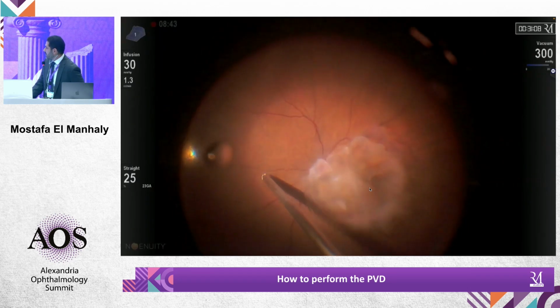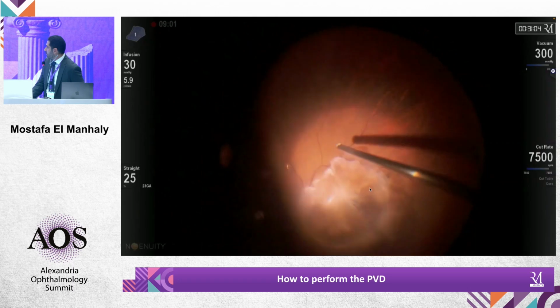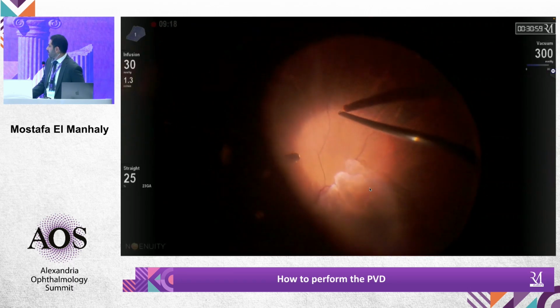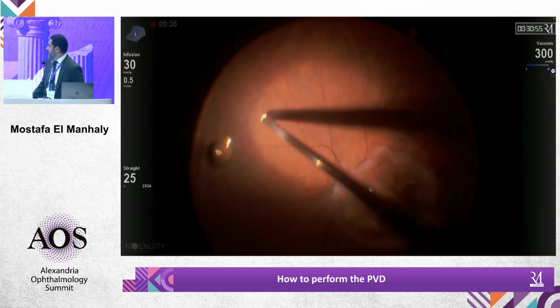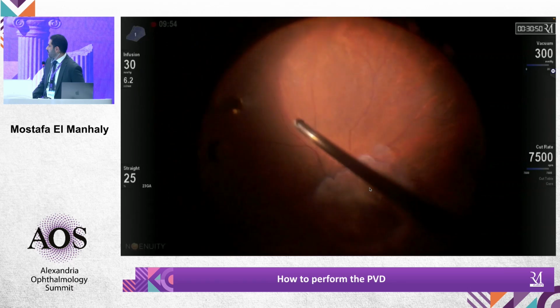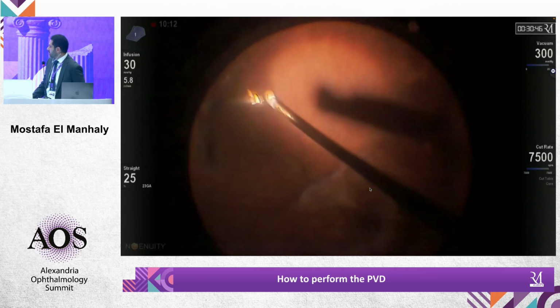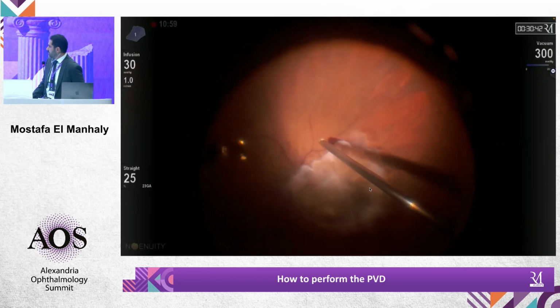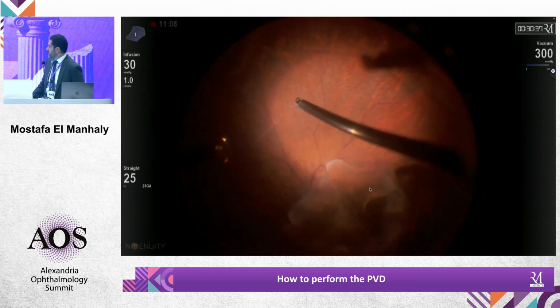Dr. Hany and Dr. Mostafa, please. Actually, if I can move this piece of nucleus in the presence of an attached posterior hyaloid, I can move it through fluid to the middle of the vitreous cavity, and I am using the bare tip of the phacoemulsification. I just do it and leave the layer of posterior hyaloid on the retina till the end, and usually it is the case.